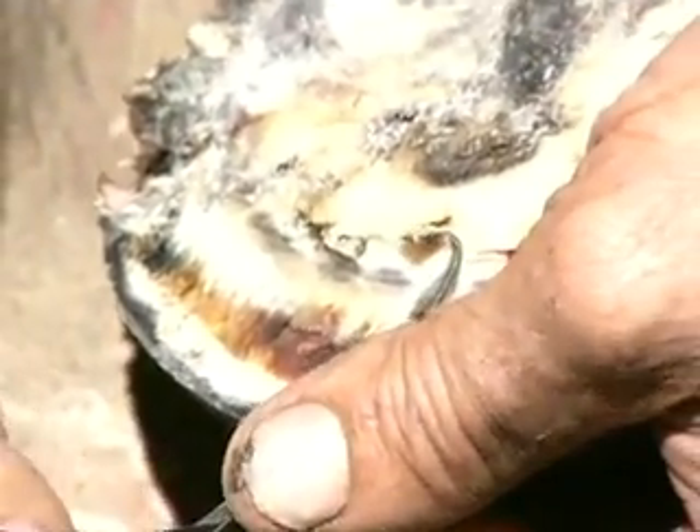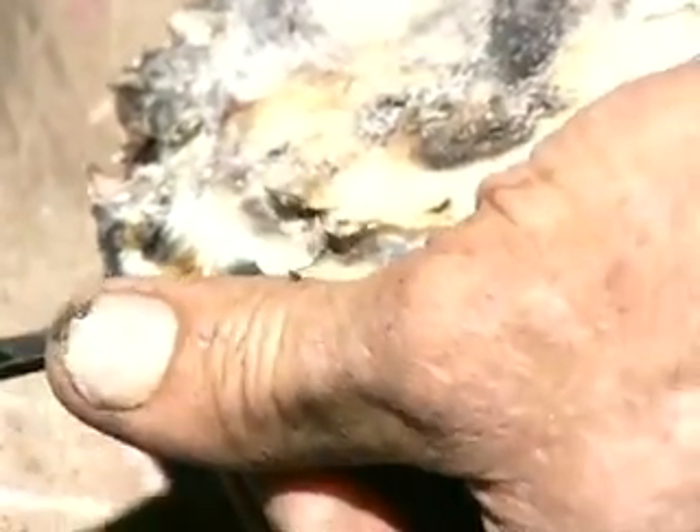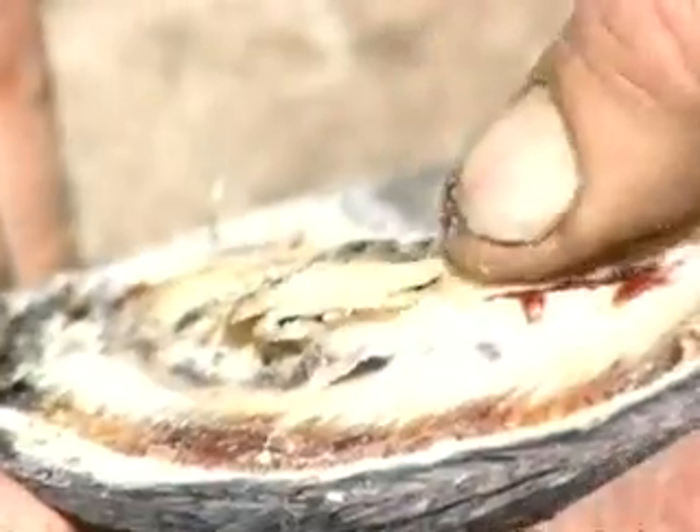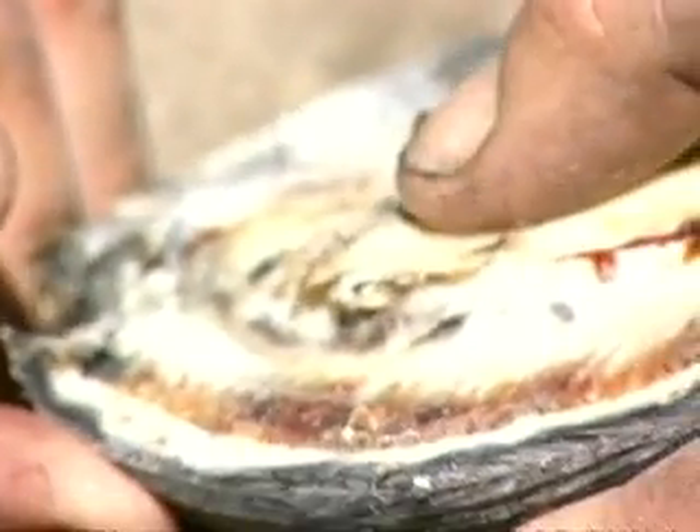Notice the exudate. We have an area right there. We want to be extremely careful because if you reach in just a little bit deeper and grab sole corium, then you're going to have proud flesh or granulation tissue. I want to unload this area and give it a healing environment for the next three to six months.